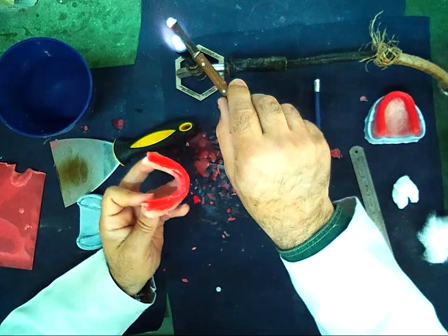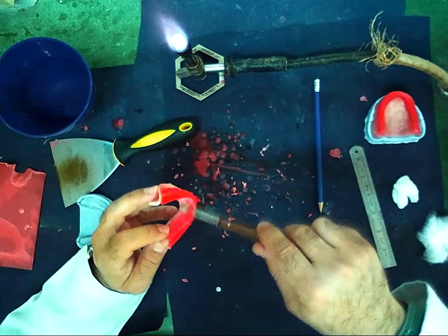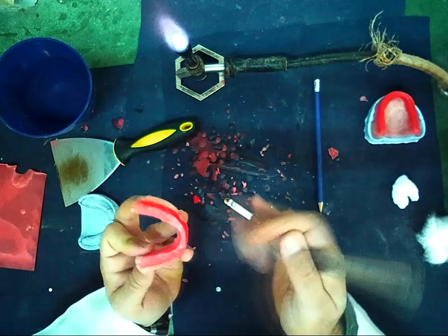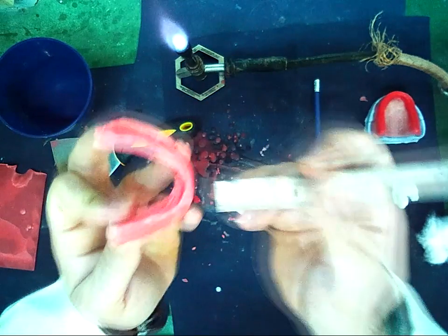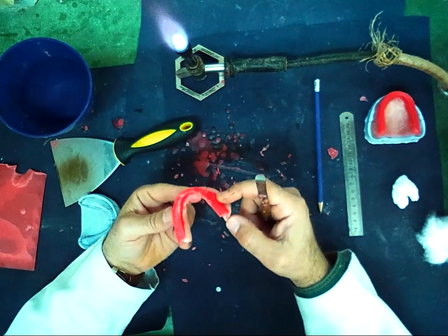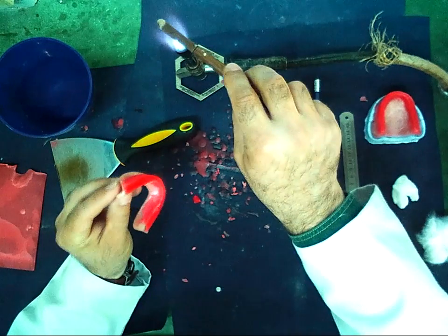It is 5 mm. Now it is 4 mm. And on the posterior, I should take from the buccal and lingual to make it 7 mm.